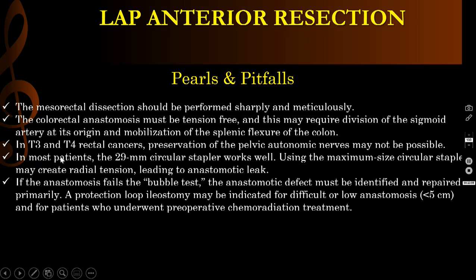In T3 and T4 rectal cancer, preservation of the pelvic autonomic nerves may not be possible. But usually T4 cases, you cannot do laparoscopically. In most patients, you have to use a 29 millimeter circular stapler.